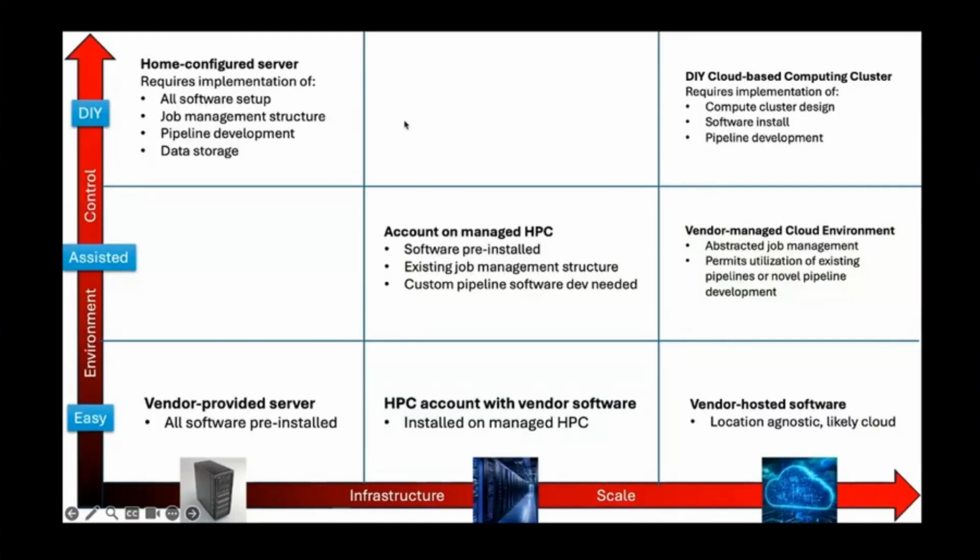In general, if you're using something that's off the shelf or vendor provided, like all the things at the bottom, there's very little work involved in running it, but you probably have minimal ability to customize the software or make it run the way that you want. These vendor options, regardless of where they're run, are going to be completely locked down. On the other hand, if you go the totally do-it-yourself route, you had better have a lot of bioinformatics support, but then you can make whatever custom analysis you want and potentially have the ability to make it very finely tuned to your particular assay.